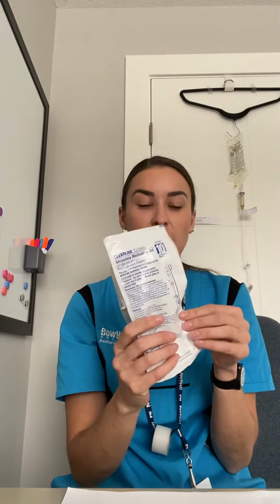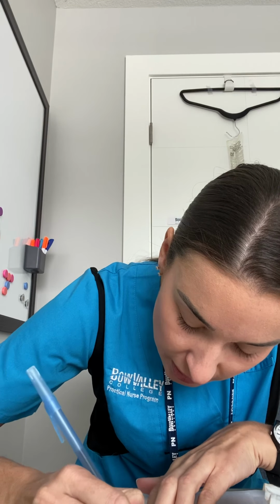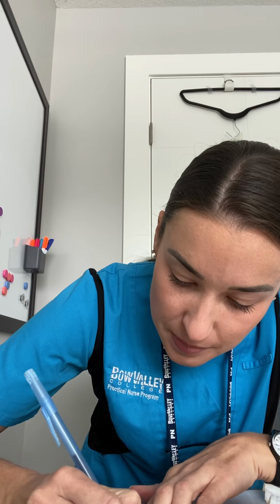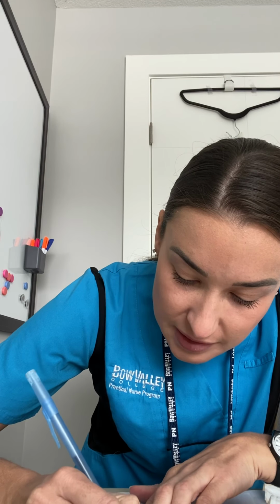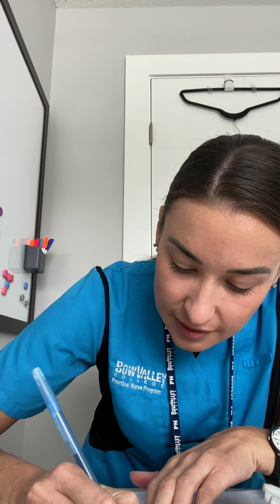Before we go into the room, we also want to bring our medication. We want to bring our secondary line here, and I'm going to fill out the secondary line label here as well while I'm sitting. So today's date, October 26, 2020. The time is 1500. My initial is JM. Secondary line.